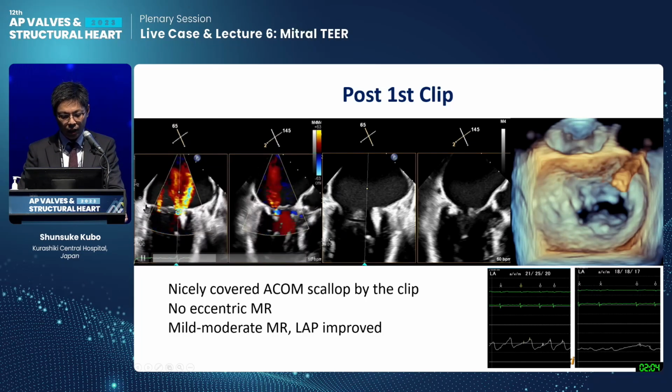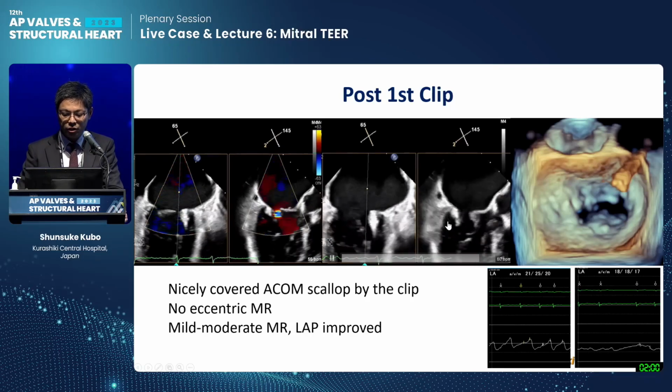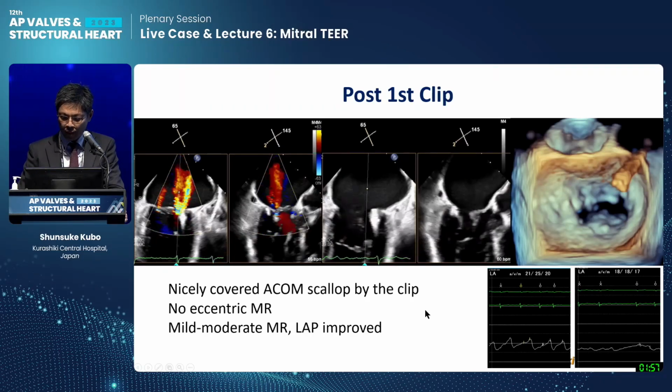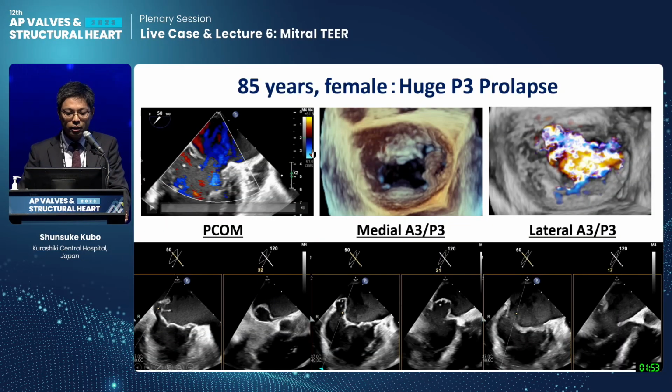There's some residual MR, but we accept it because you can see that there's a lot of marking here. So hemodynamic improved. So final case is 85 years old.